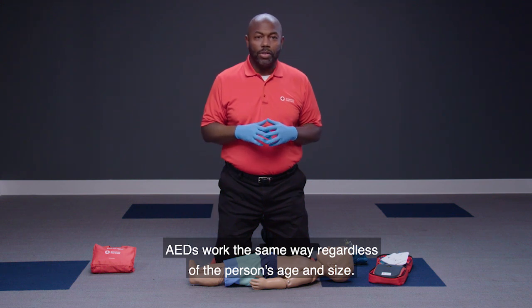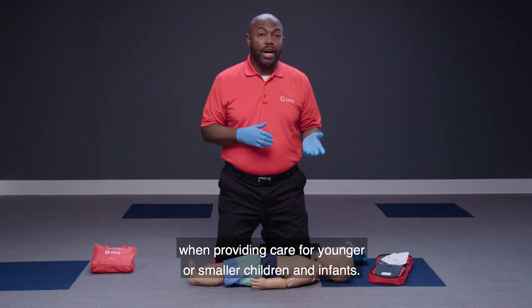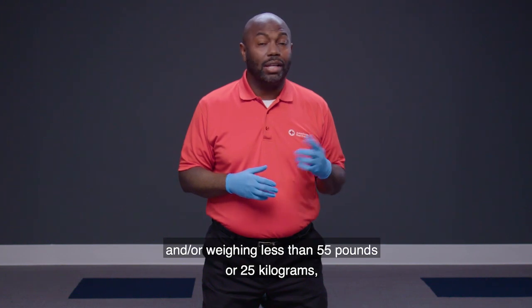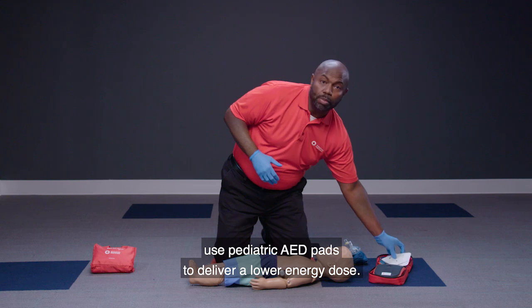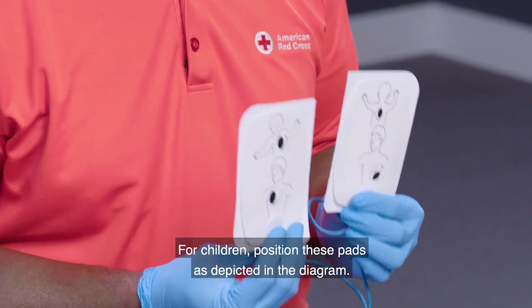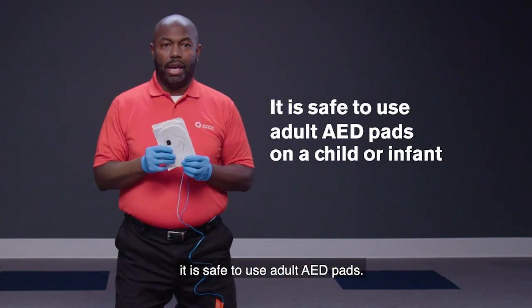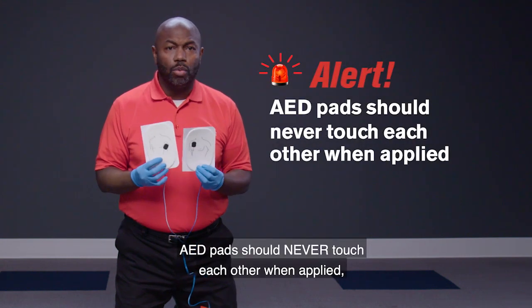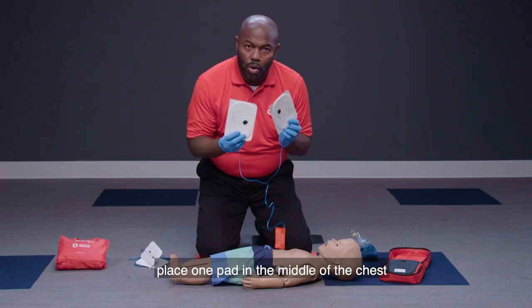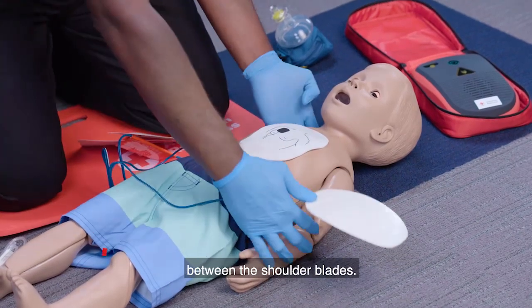AEDs work the same way regardless of the person's age and size. However, there are differences in AED pad selection and positioning for younger or smaller children and infants. For children up to eight years of age, including infants, or weighing less than 55 pounds or 25 kilograms, use pediatric AED pads to deliver a lower energy dose. If pediatric AED pads are not available, it is safe to use adult AED pads, but the pads should never touch each other. If they would touch, place one pad in the middle of the chest and the other on the back between the shoulder blades.